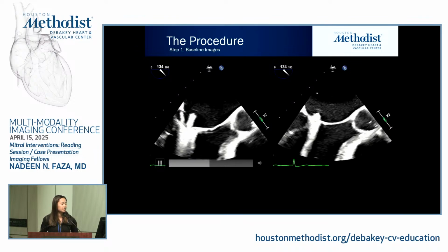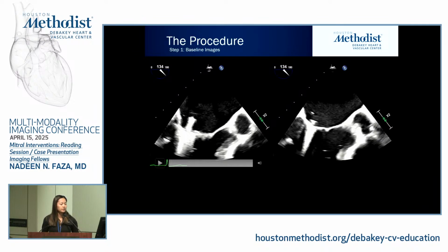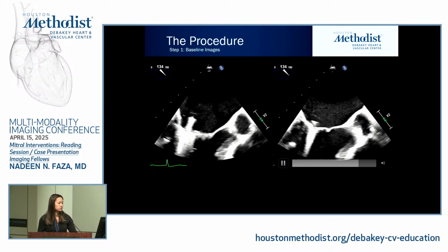That's when we say that it's bouncing, meaning that the leaflet itself is tucked in within the two arms itself. And then they close the arm itself, and on the right side you can see that those are good tissue bridges. That means that it's a good grasp. So we really want to make sure that happens, because otherwise there could be a detachment as well.